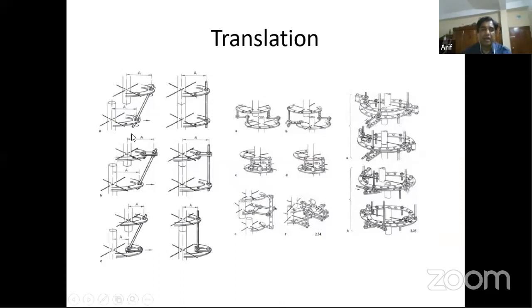If you remember from my previous session, if you fix the rods or rings at the same distance in both the proximal and distal fragment, if you follow the cursor, the same distance from the longitudinal axis, and tighten the rod itself, it can correct this type of translation deformity. Even just follow the cursor, the A is here, A is here. Just tighten the rod, and the translation deformity is corrected. So it is very easily corrected by this type of rod technique. I already told you in my previous lecture.